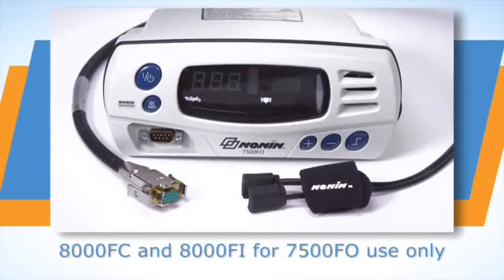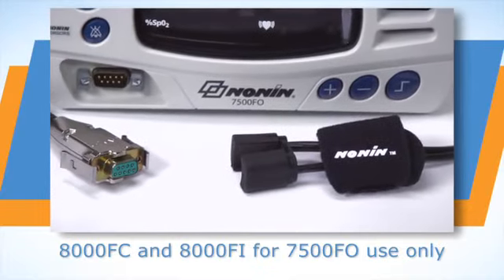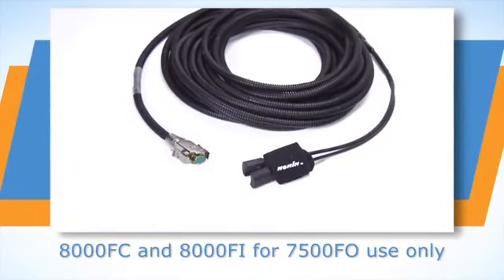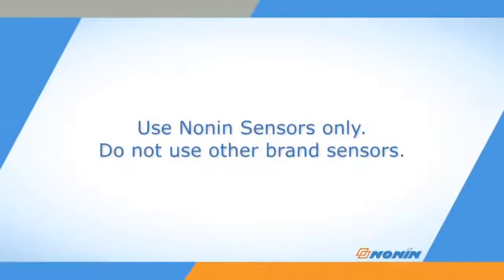The 7500 FO model has the same functions as the 7500 model, but is configured for use of Nonin 8000 FC or 8000 FI fiber optic sensors only. All Nonin brand pulse oximeters are designed for use with Nonin brand sensors only. Do not use these pulse oximeters with other brand sensors.